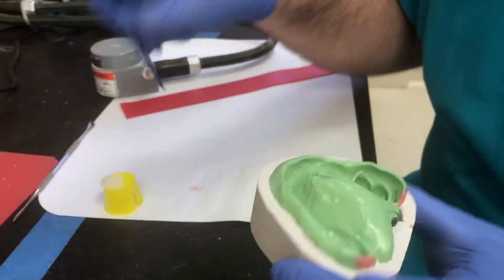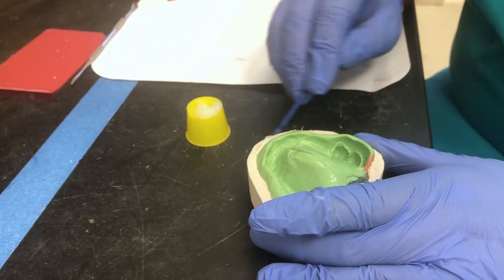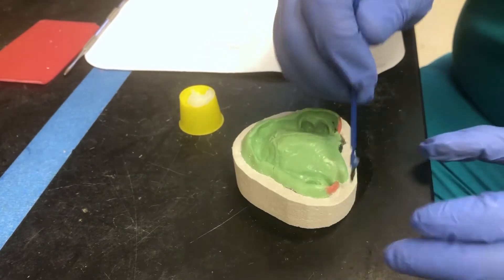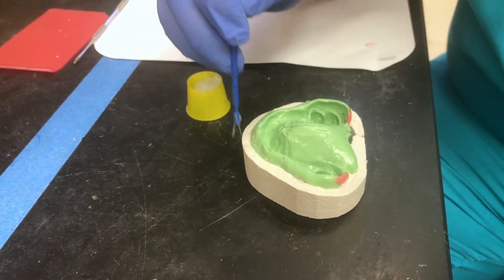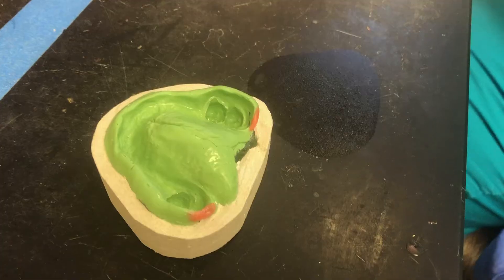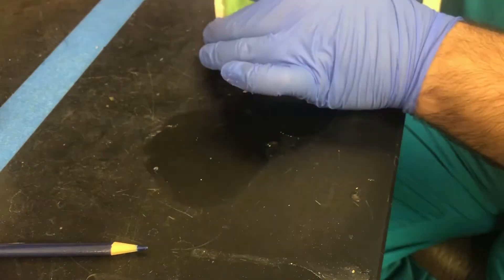The next step is to make sure you Vaseline the pumice — it's very important. Before you pour it up, you want to Vaseline it. Try to avoid getting much Vaseline on the impression itself. I'm just Vaselining the pumice on the border — not the entire thing, just the top occlusal side. If I do get some on the impression, I just wipe it off. The purpose of the Vaseline is so when you pour up the MicroStone, it'll be easier to separate the cast.